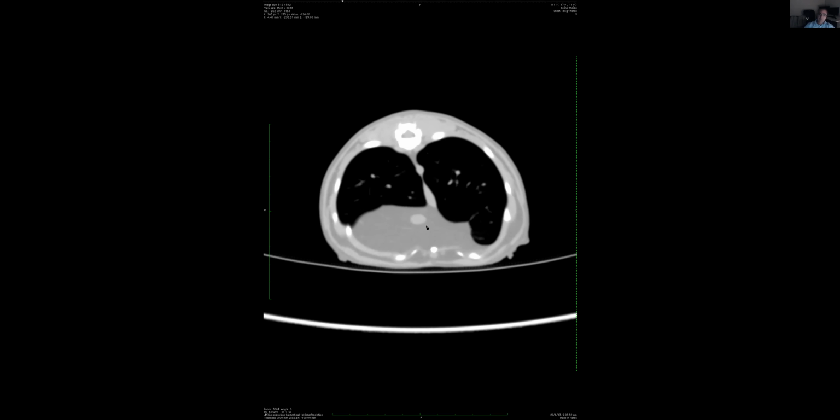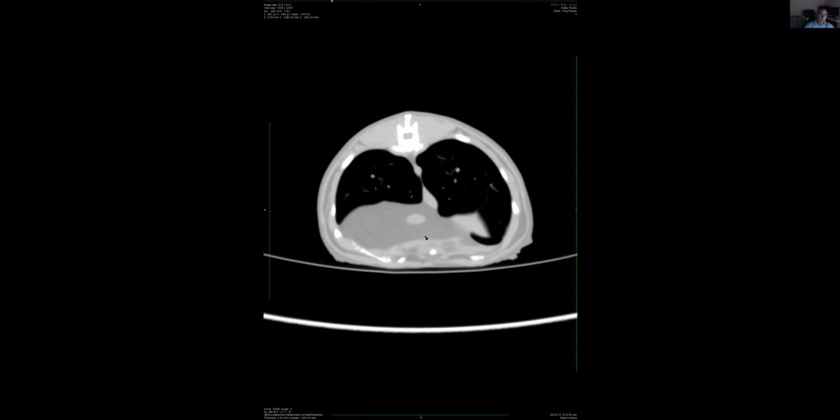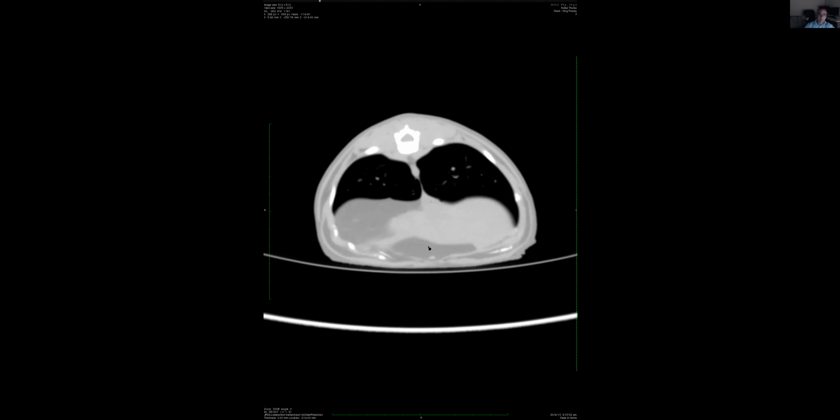So in this case, I also love that I have the CT. Makes sense? So now I can clearly show the difference between soft tissue, fat, gas, bone. These are the players of our game. And how they interact when they are in contact, when they are not in contact, when they superimpose or when they're not superimposed, are key elements of our game. If you understand those concepts, then you can untangle the cases in a nice, logical way.